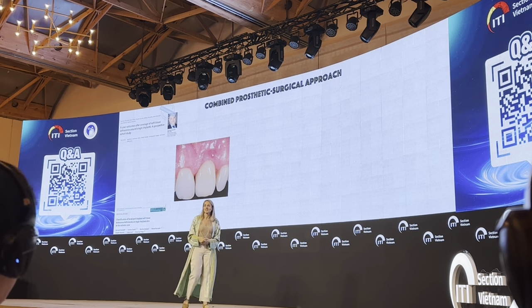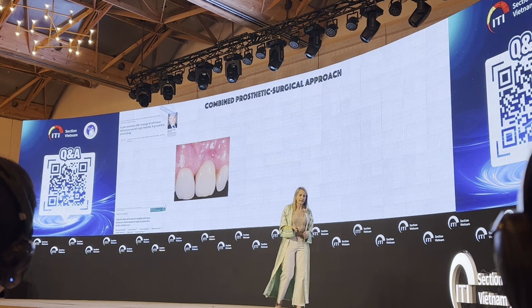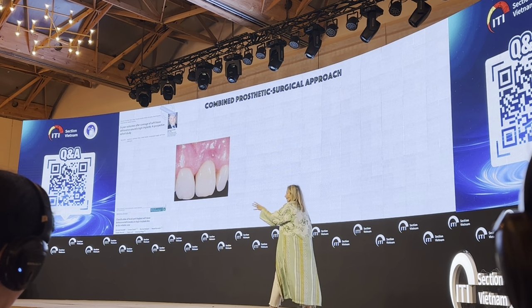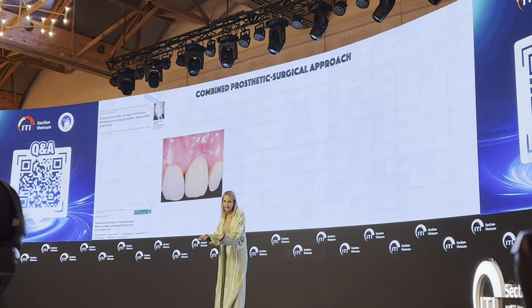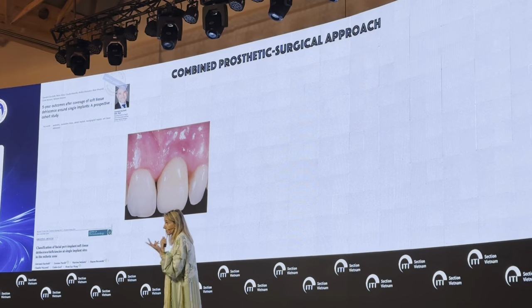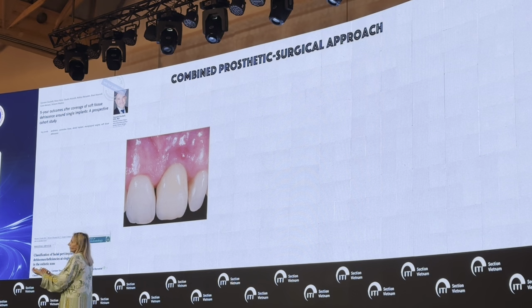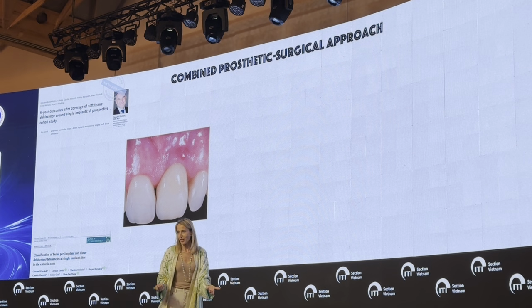So I brought the patient and asked what we could do, and the professor said we have to remove the crown to check the implant head. And during the crown removal, I broke the crown completely. But since we are a perio department, we didn't have at that time a good restorative material to provide the patient a nice provisional restoration.